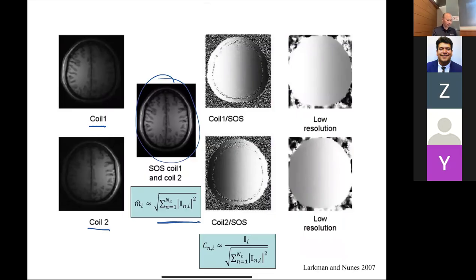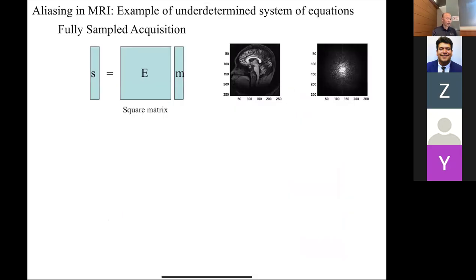So that's how you should combine the data if you didn't really want to go faster. All right. But let's say in general, we want to go faster. And some of your projects will look at this, and there's always this pressure to go faster in medical imaging, right? Because either it's monetary or it makes possible a technology that's not possible if it's too slow.